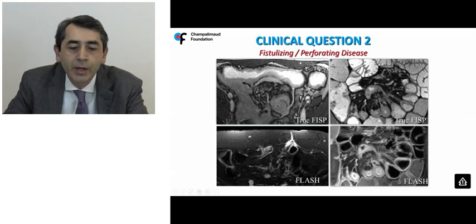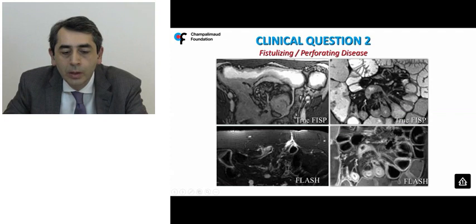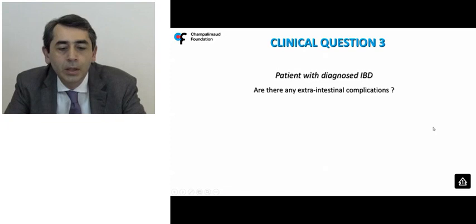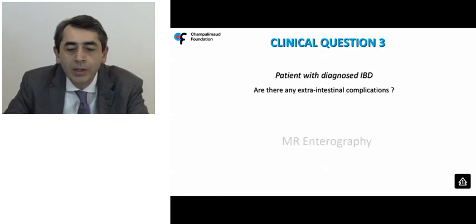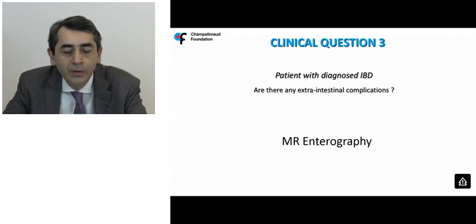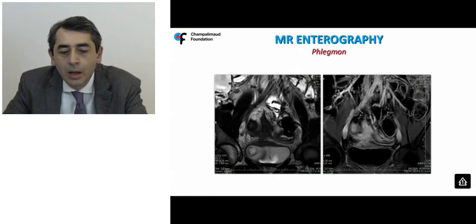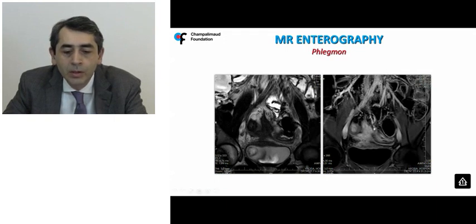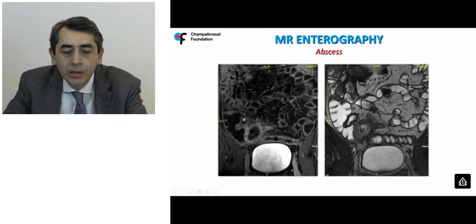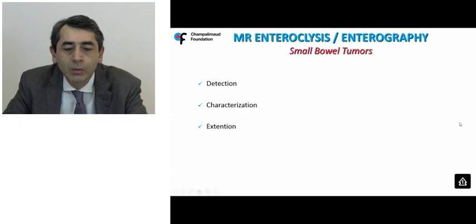For fistulizing/perforating disease, MR enteroclysis can demonstrate entero-enteric fistulas and enterocutaneous fistulas, shown by increased contrast uptake due to perifistulous inflammation. For extra-intestinal complications in Crohn's patients — where adequate luminal distension is not of primary importance — MR enterography can easily disclose inflammatory masses such as phlegmons or abscesses, seen on both TruFISP and post-contrast T1-weighted sequences.